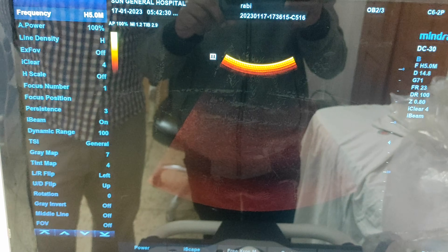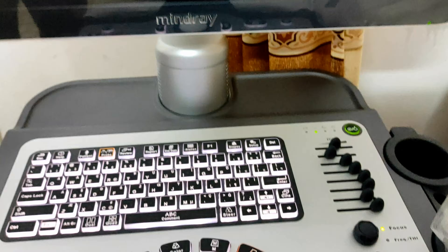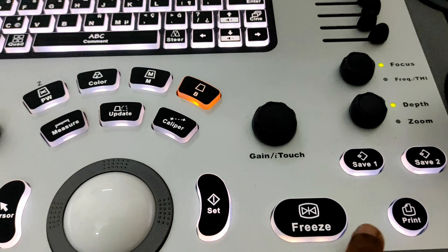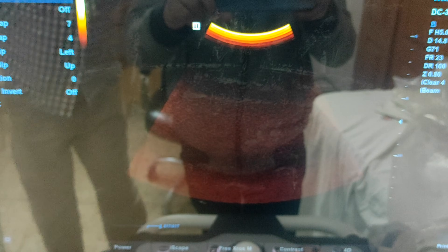Our screen remains unfrozen because something is moving on the screen. To freeze it, here is our freeze button. Just press it to freeze. Now nothing is moving on the screen — that means our screen is frozen.